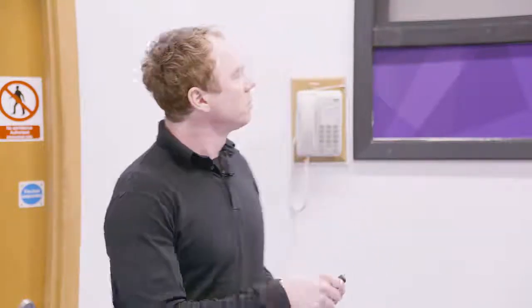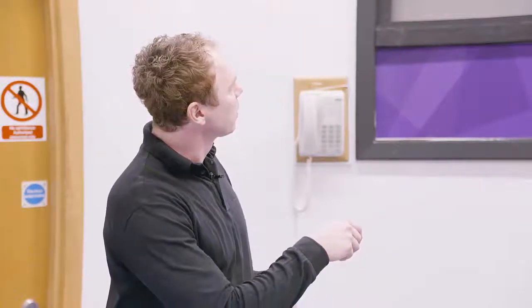If you do something that will generate fatigue, you can also detect fatigue, but the biggest change in contraction time will be immediately after an injury. After an injury you have inhibition, which prevents part of the muscle fibers from contracting, and you will see a big shift to the right. So this contraction time will prolong drastically. Probably this is one of the reasons why contraction time is the parameter that we monitor closely.